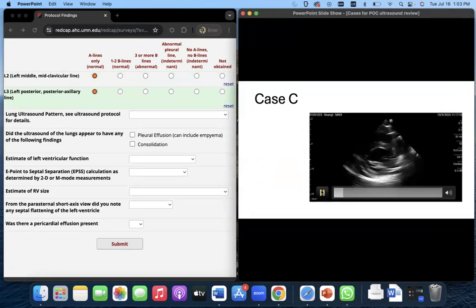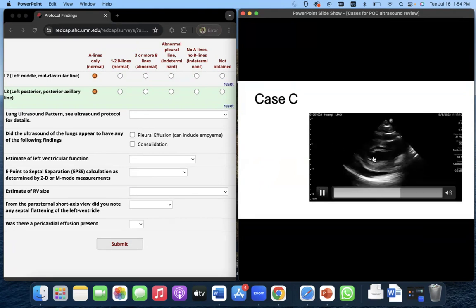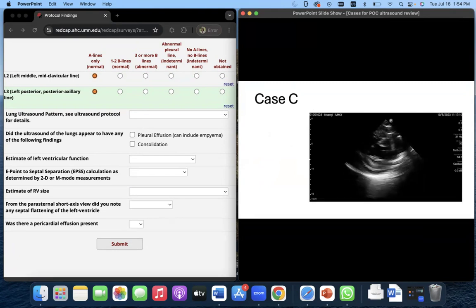Here's our parasternal short axis. Again, nice tiny little circles, almost like the ventricle's getting a little squished there. Technically, this image is a little high. You can see the fish mouth of the mitral valve, and ideally we would want to be down a little lower so that we see the papillary muscles. So it's a little bit high for the perfect assessment of the LV, but in combination with this picture and the parasternal long axis, we know that we've got a completely collapsing hyperdynamic LV here. And so, just putting that all together.